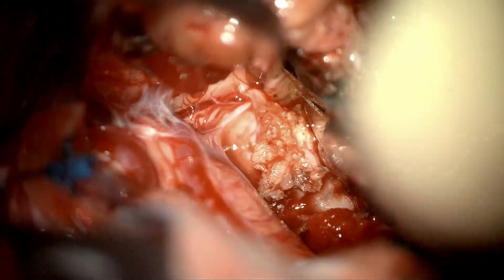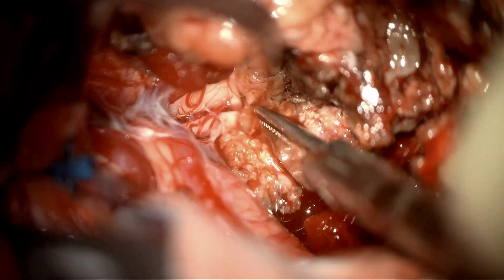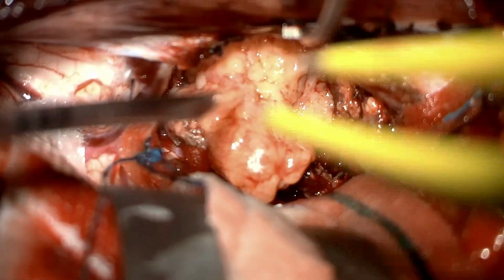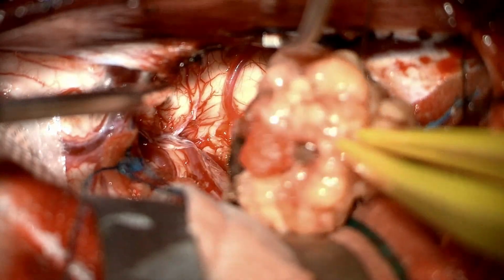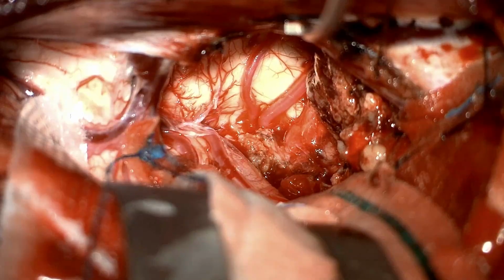Finally, we free the last attachment of the tumor from the tentorium in order to see this last portion of the tumor. The tumor capsule is removed in one piece.